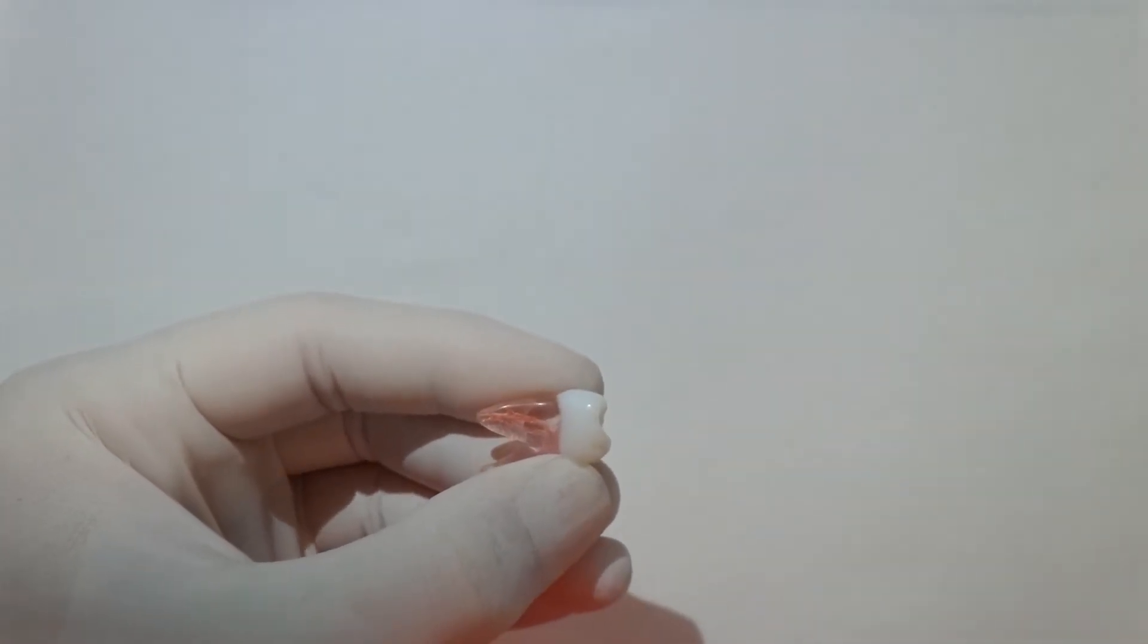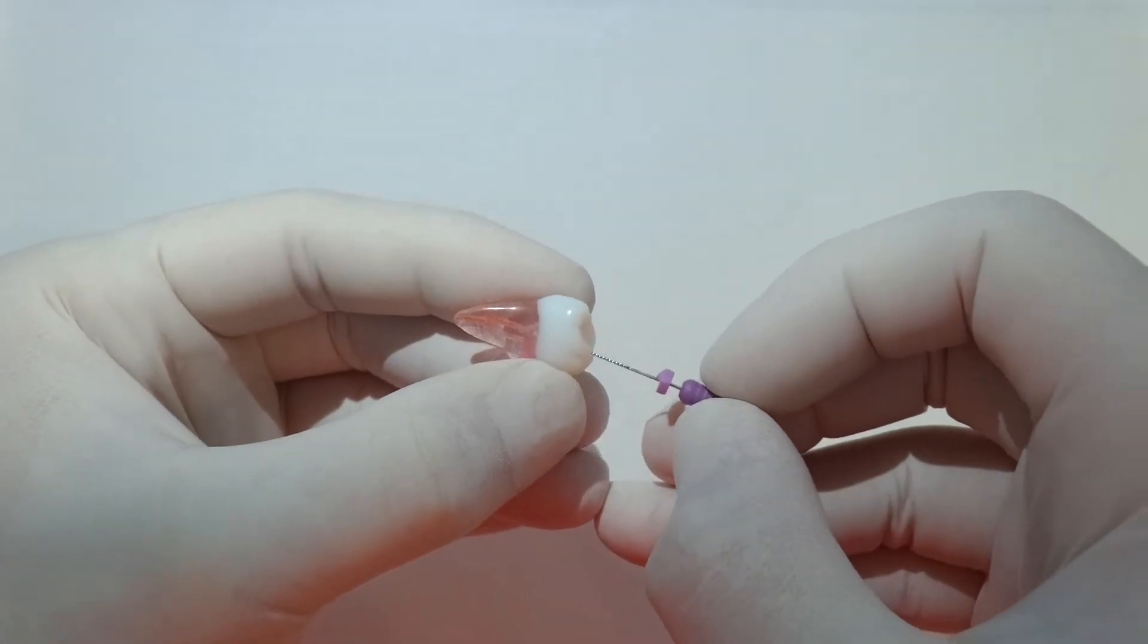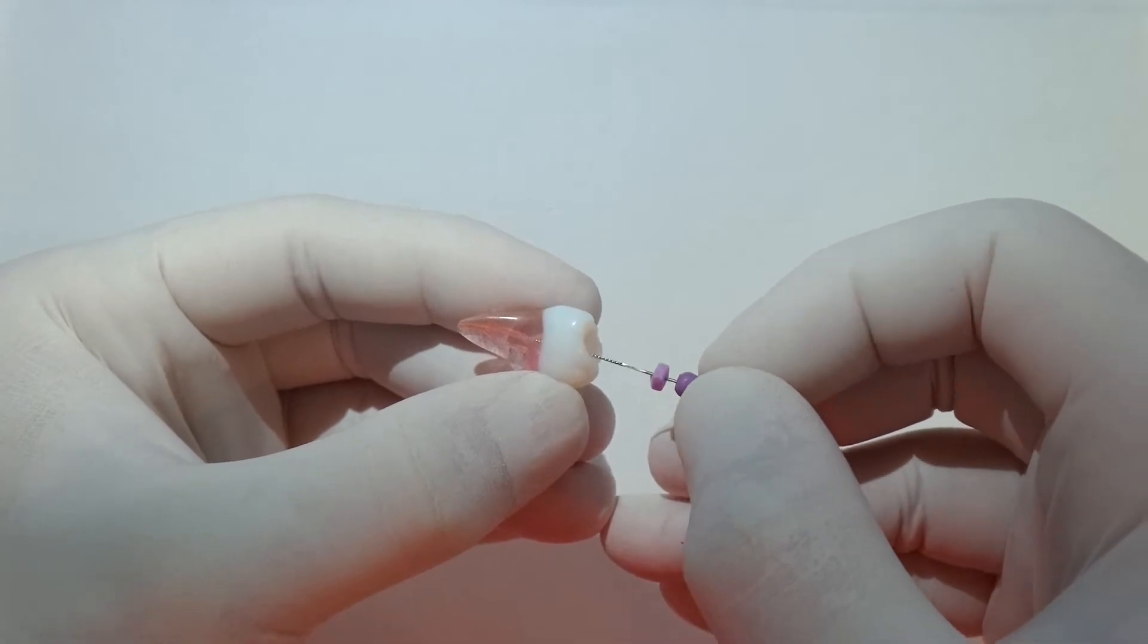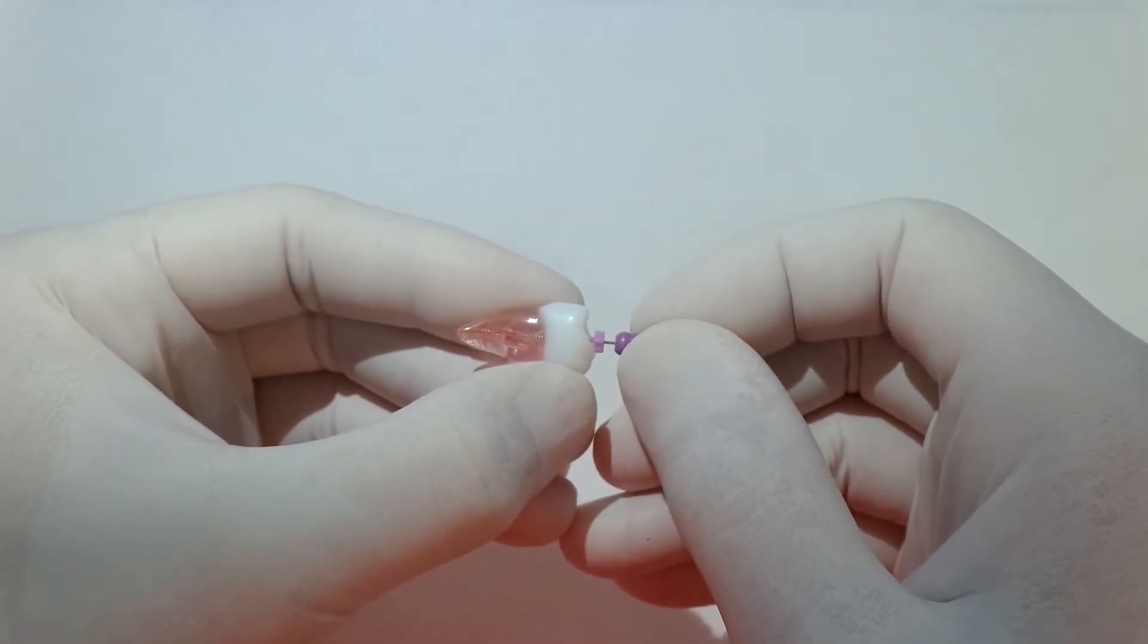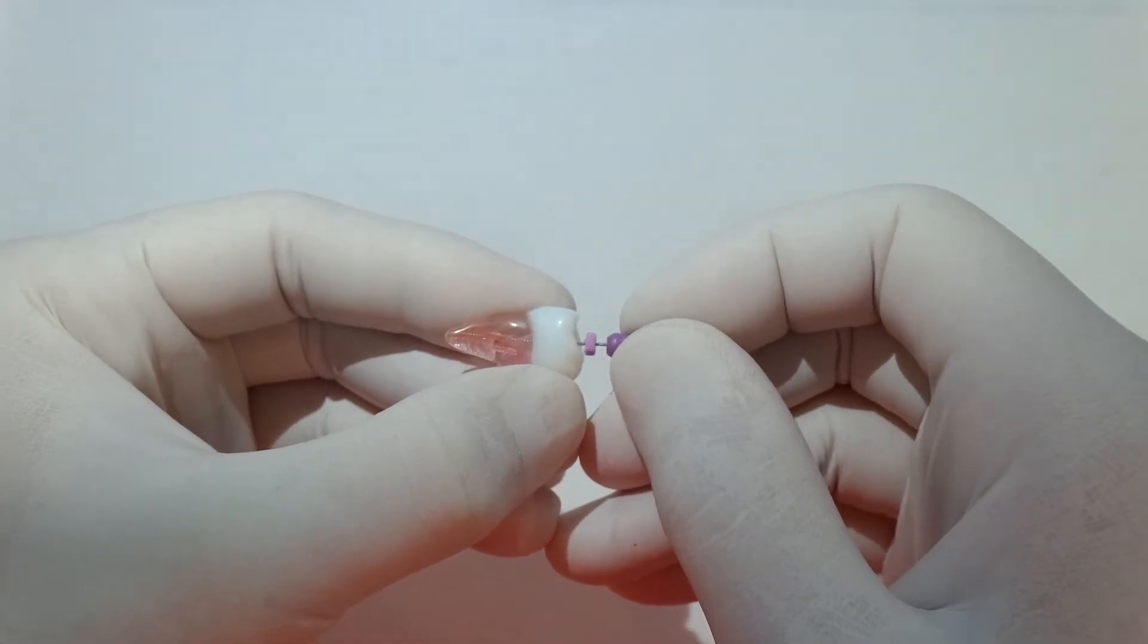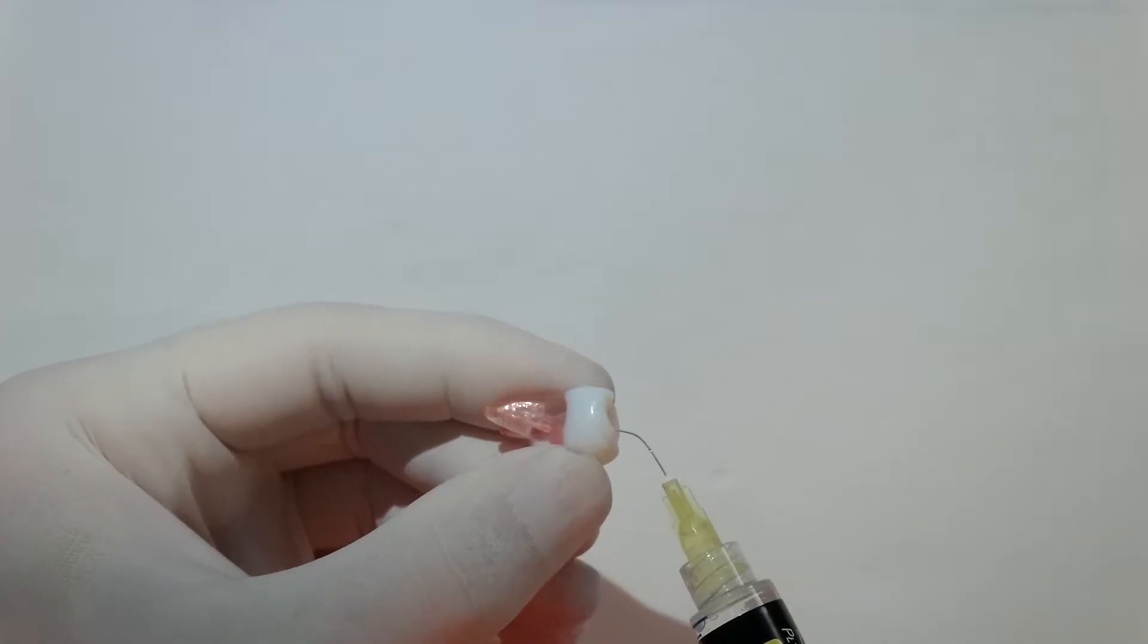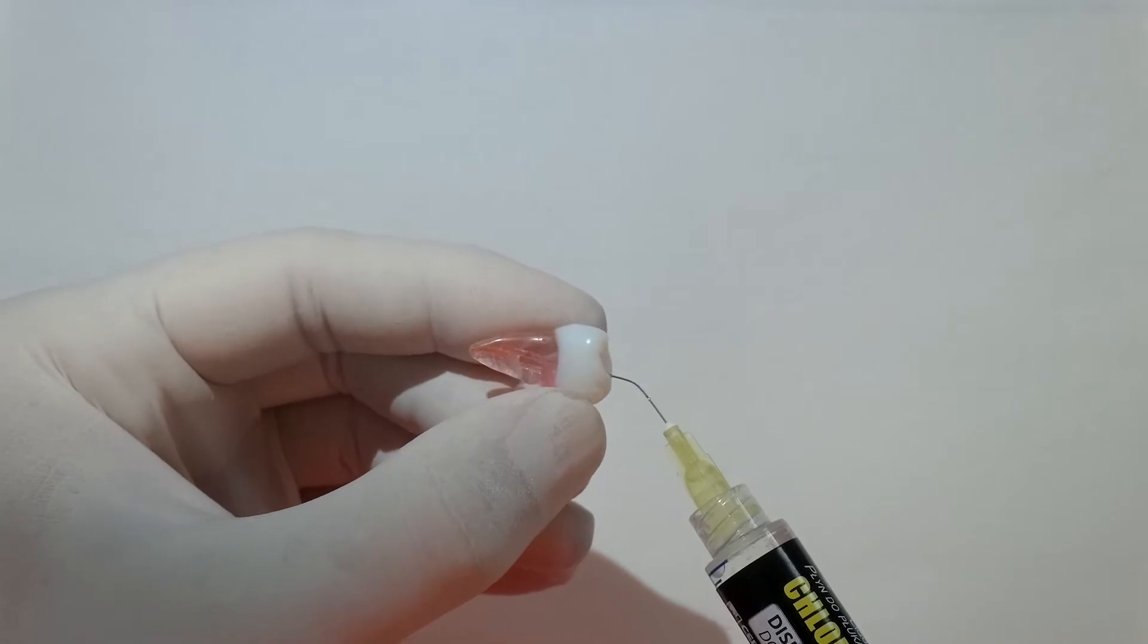Really important in between each of these files that we irrigate, we patency file, we make sure there's no blockages right at the very end of the canal. That's nicely patent still, we'll irrigate with some sodium hypochlorite, just make sure there's no debris accumulating.